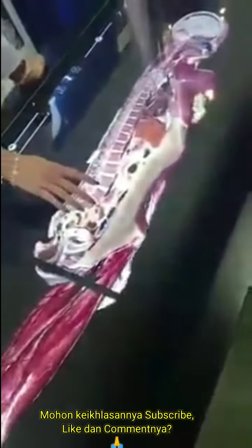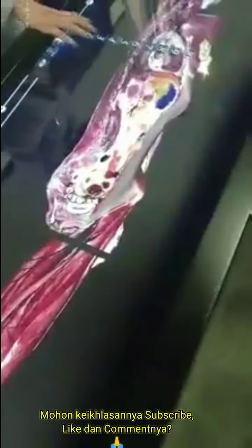I can start off with cutting down the middle. And then from here, I can show the anatomy as it was at the time of death. So everything is accurate, there's no rendering done. Since the cadaver was flash frozen, there were scans that were taken of the cadaver itself, and then from there you can see the anatomy as it was at the time of death.